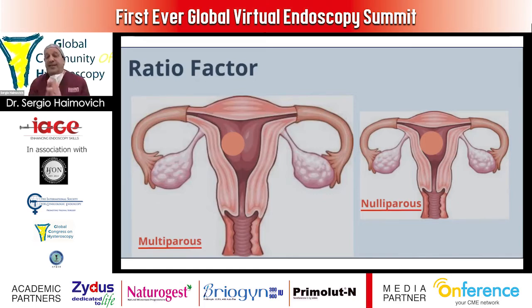And in the nulliparous uterus, you don't have enough space and you have more technical difficulties doing this kind of surgery. So this ratio, the ratio between the container and the contents, is something important in order to determine the success of the surgery.